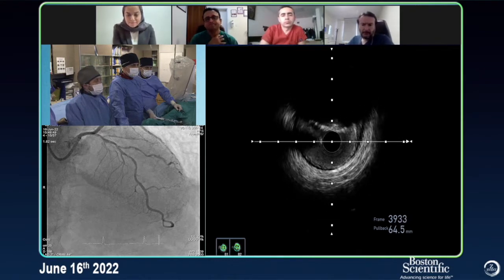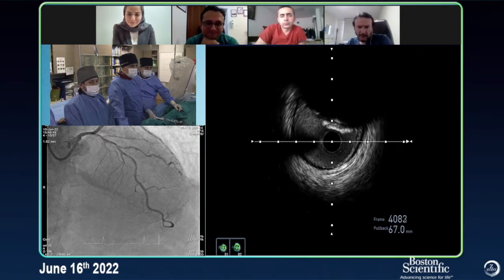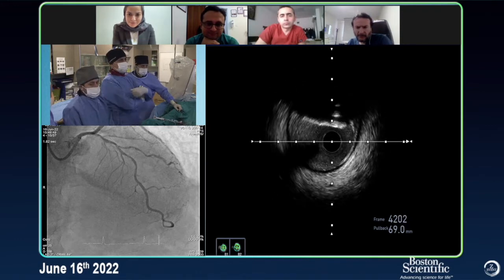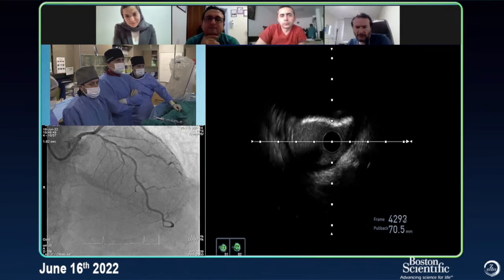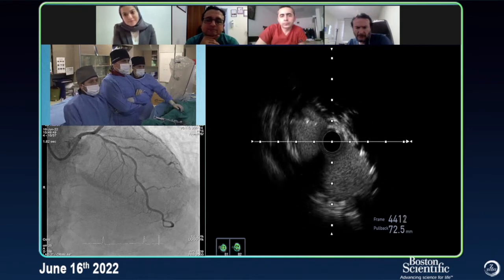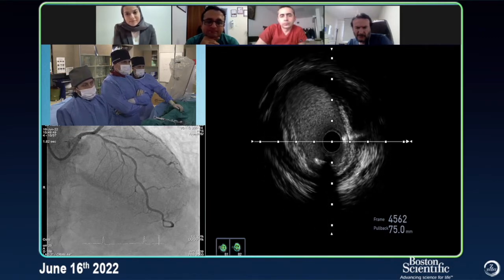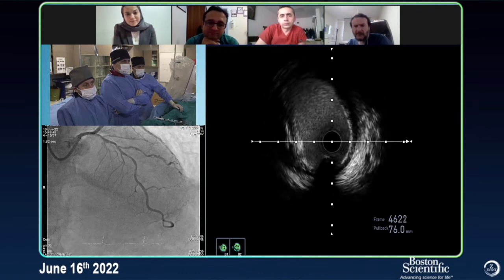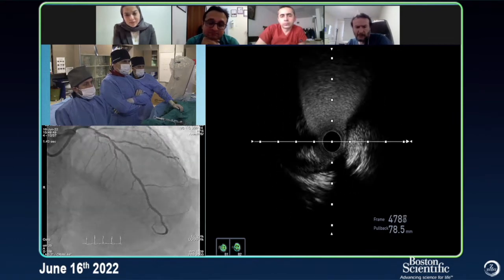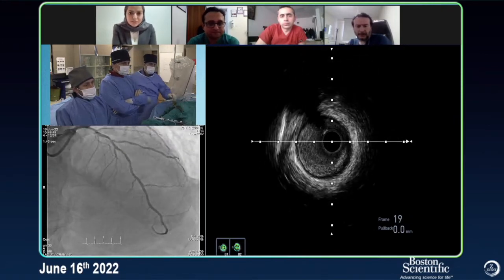Now the circumflex will come — please note the ostium of the LAD and whether we cover it or not. I think that's the important decision we have to make: whether to stent the LAD from the left main or not. This is the circumflex. They packed this stent just at the ostium, which is nice. Left main is around 5.5 mm. This is the IVUS before rotablation. Excellent demonstration.